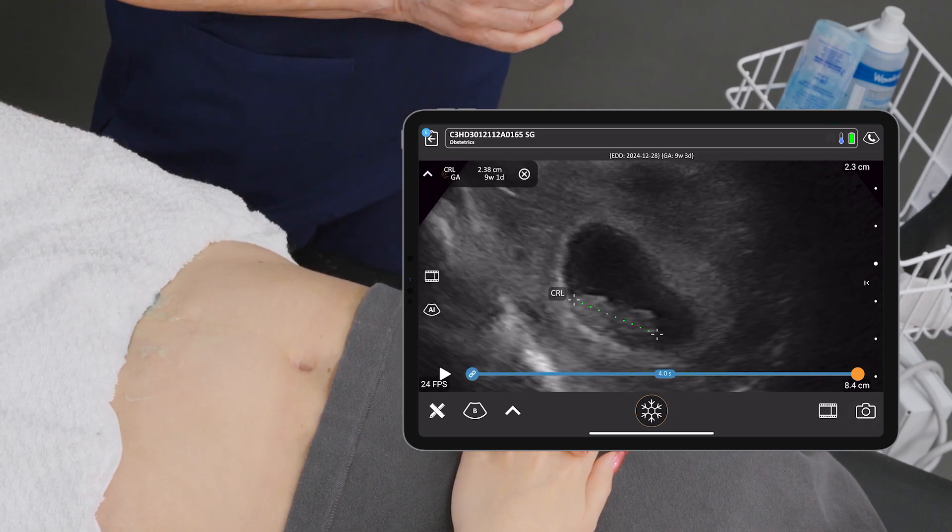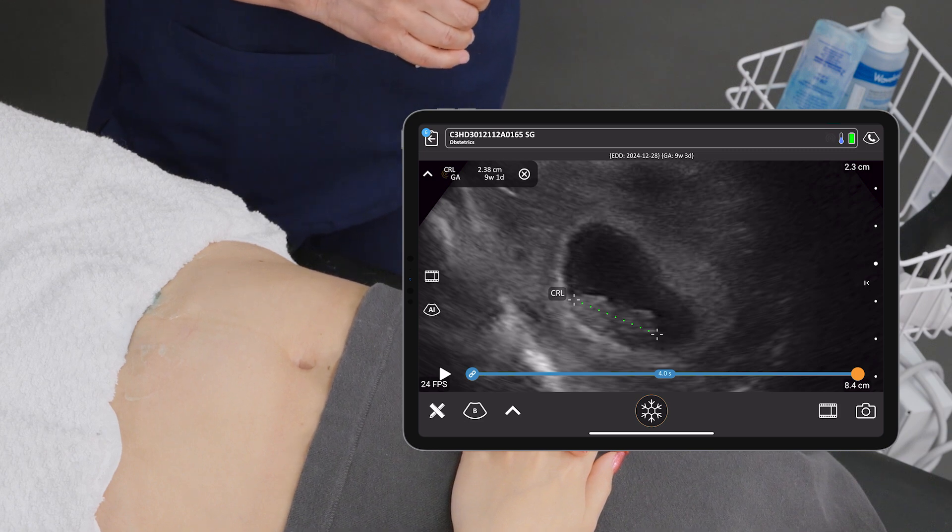So there we have it — a crown rump length with a gestational age estimate of nine weeks, one day.